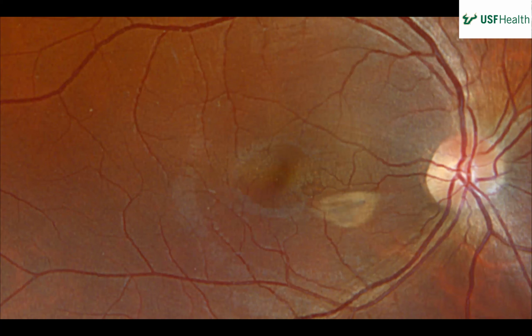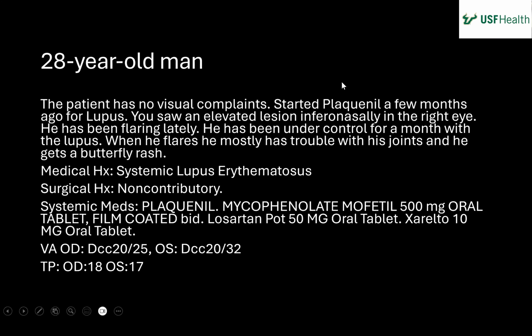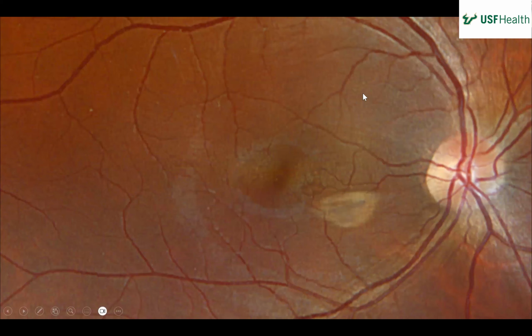So you were saying the level. What level is that? Intraretinal, subretinal, or preretinal? I feel like I can see the vessels a little overlying it at the edges. On the side, but in the middle, not so much. Look at the vessel up here on top. Some you can, some you can't. The vessel on top, you can follow, right? But this vessel, if you follow it, it's like, I wonder what it did. It's like you put a napkin over the vessel.